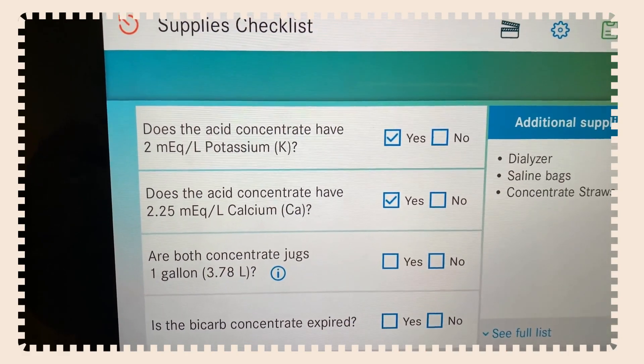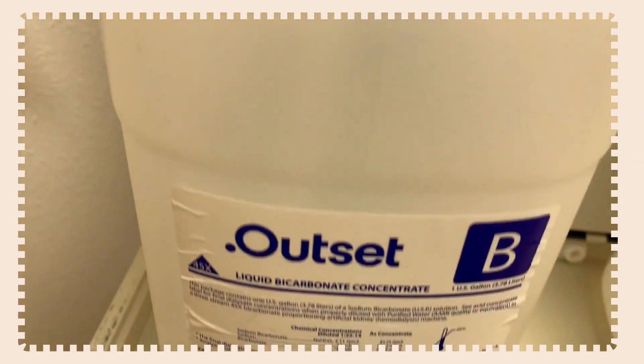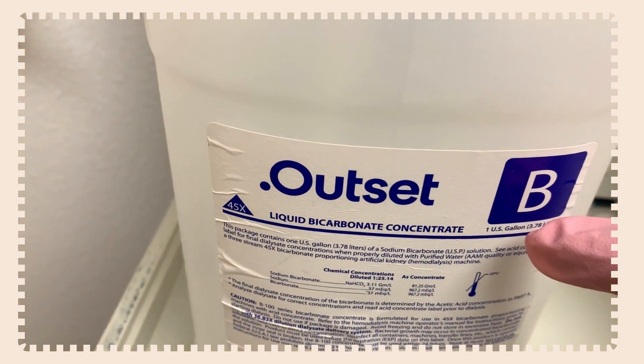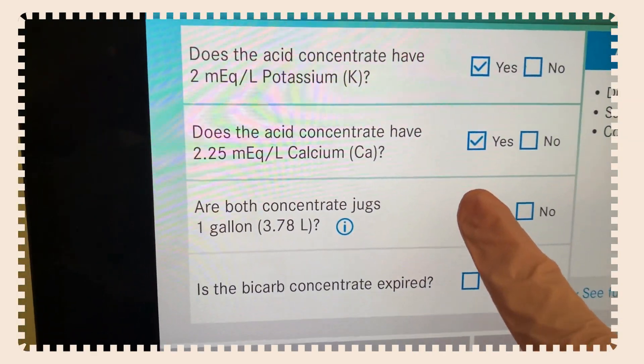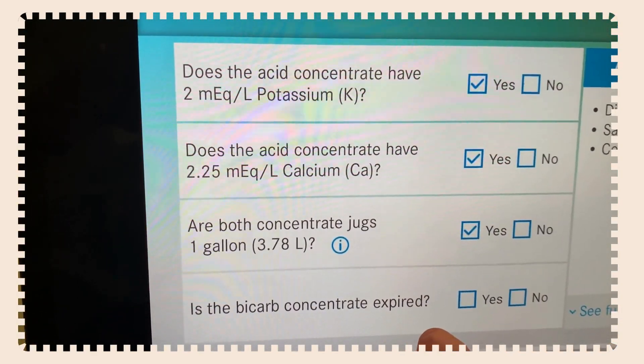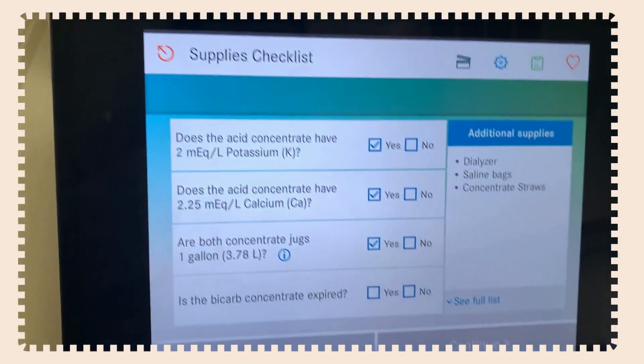Are both concentration jugs one gallon? This is where you find the one-gallon mark on the jug, right underneath the B. Hit yes for both jugs. Then it asks: is the bicarb concentrate expired? You can see the expiration date right on the jug. In this case it is not expired, so we confirm and continue.